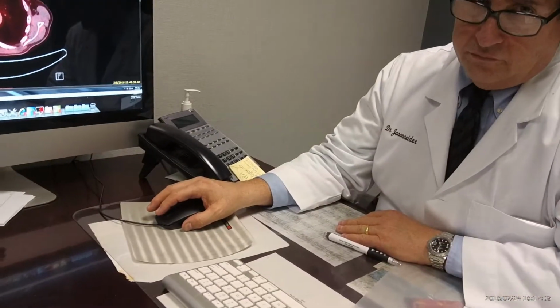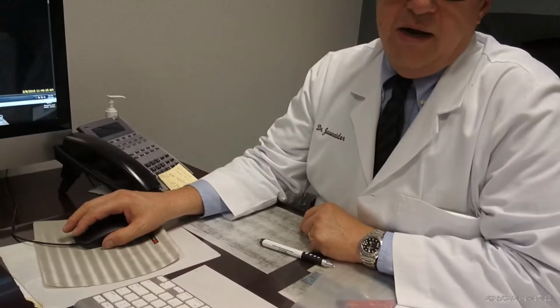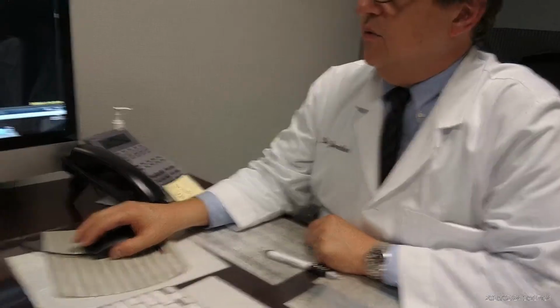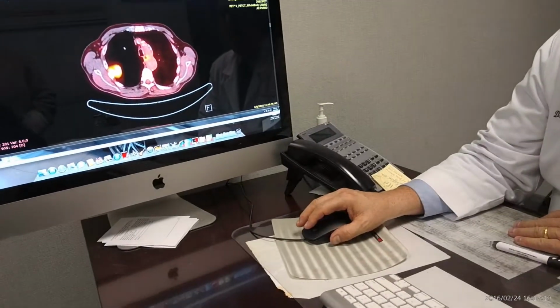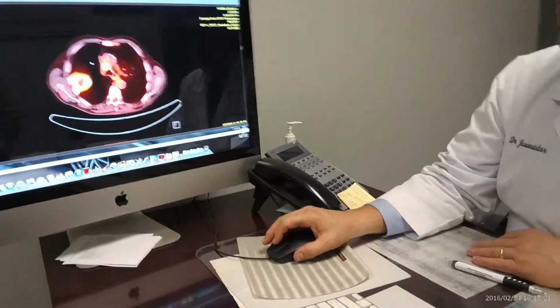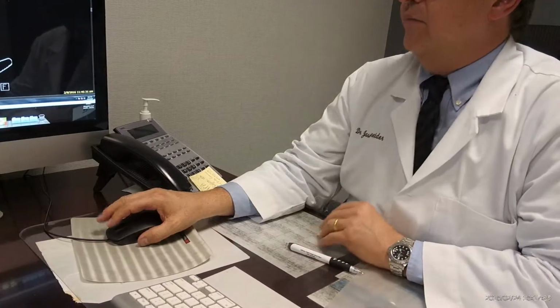Will that determine the aggressiveness or the type of the tumor? This tells us that you better biopsy something here to figure out what this is, because there's a very good likelihood that this is a tumor. Now, as we come through the rest of the body, you start to see that something else is lighting up here as well, and it's glowing quite bright.